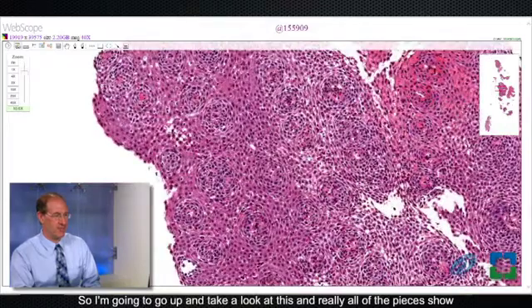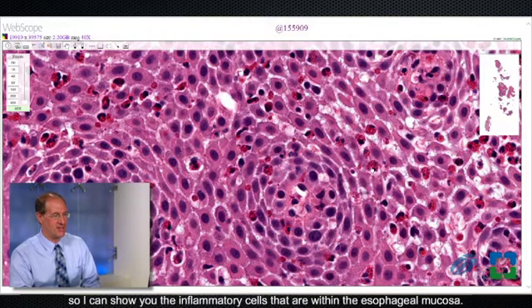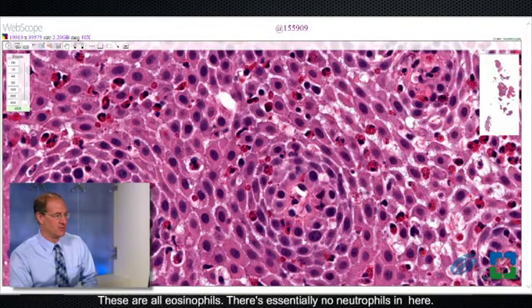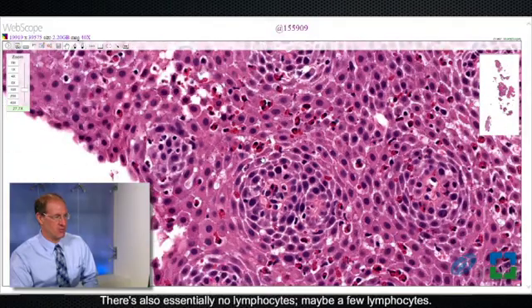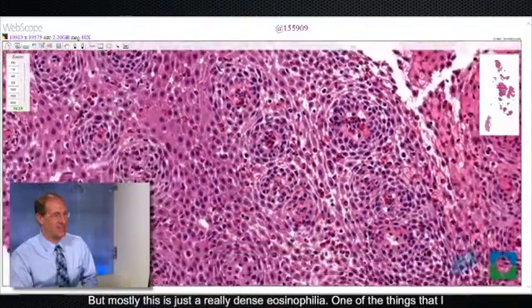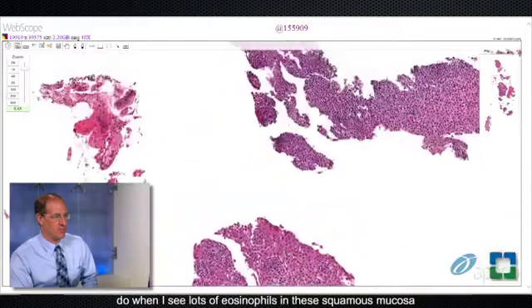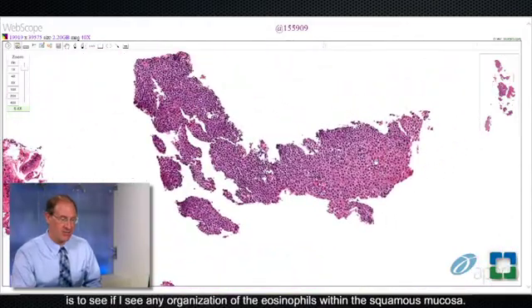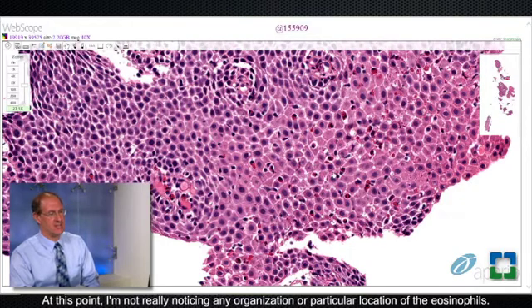All of the pieces show very similar features. Zooming up to high magnification, I can show you the inflammatory cells within the esophageal mucosa. These are all eosinophils. There's essentially no neutrophils in here, and essentially no lymphocytes — maybe a few lymphocytes — but mostly this is just a really dense eosinophilia. One of the things I do when I see lots of eosinophils in the squamous mucosa is to see if there is any organization of the eosinophils, and at this point I'm not really noticing any.